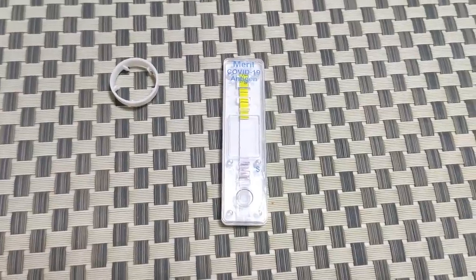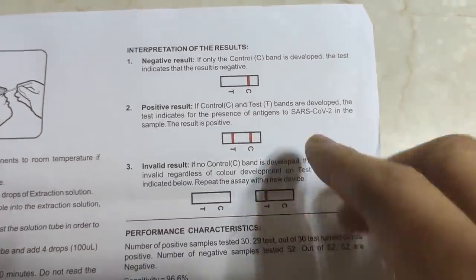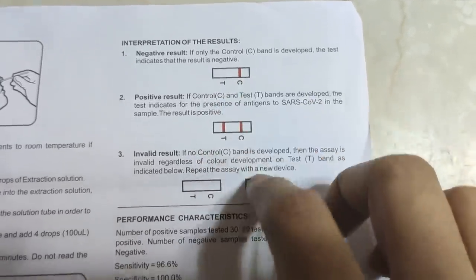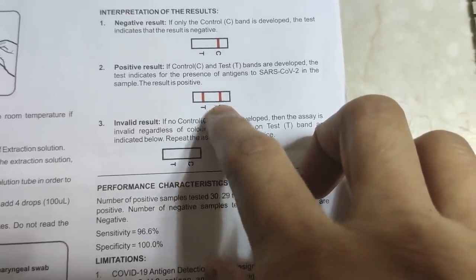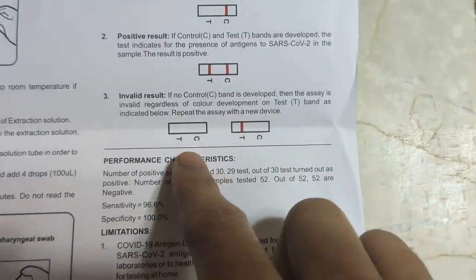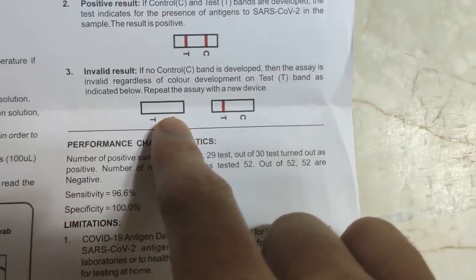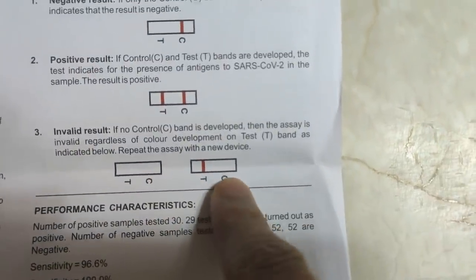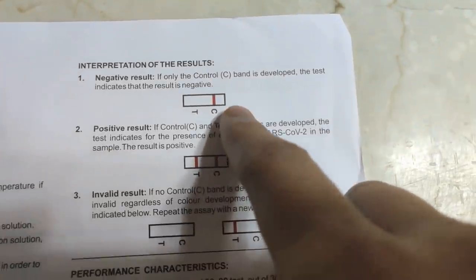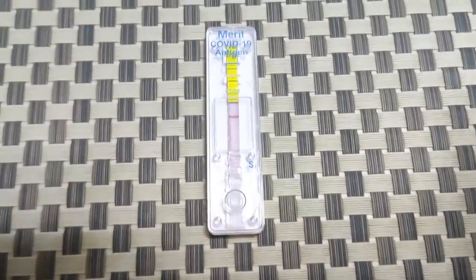While it processes, let's talk about reading the results. If you get one line in C — C means control — that is a valid negative result. If you get two lines, one in C and one in T, that means you tested positive. If you get no band in C or T, the result is invalid. We only accept results when there is a band in C alone, or bands in both C and T.